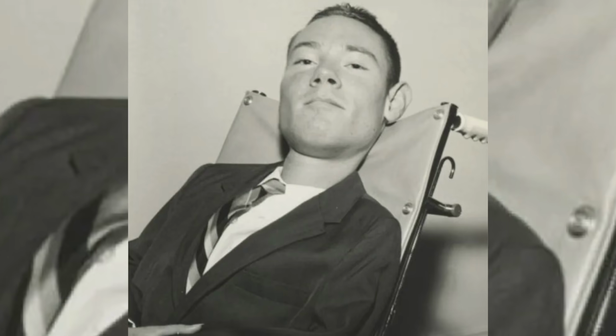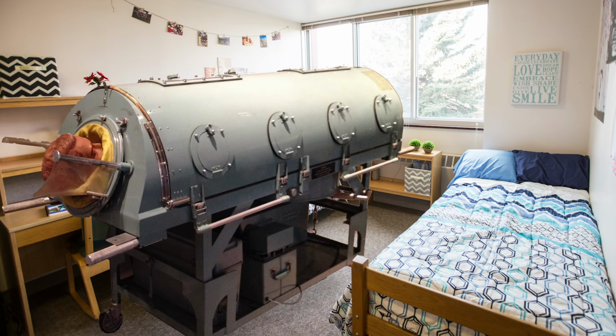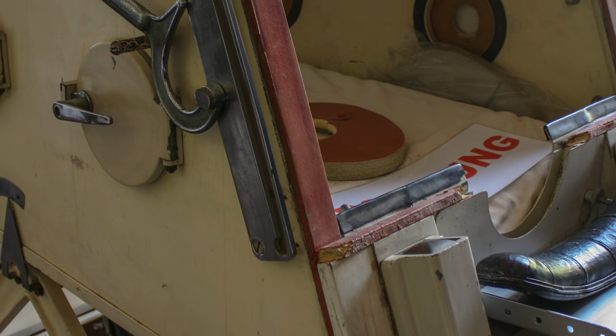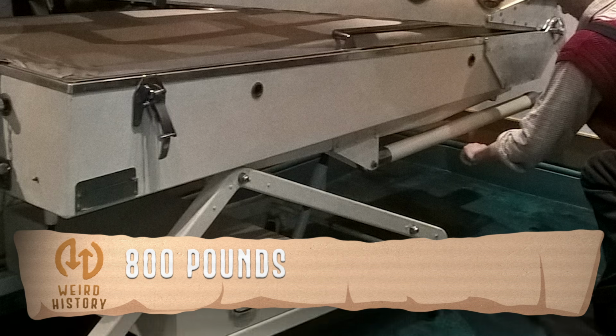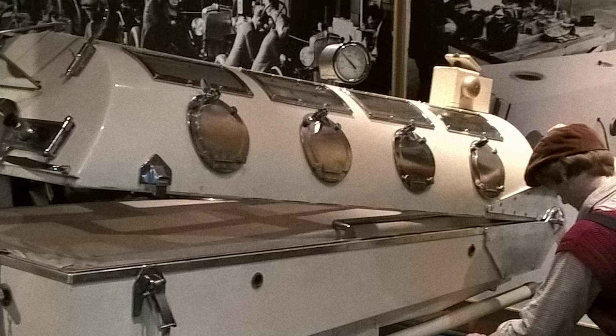Earlier, when we mentioned attorney at law Paul Alexander hauling his iron lung into his dorm room, we probably should have mentioned that these bad boys weighed hundreds of pounds. Not exactly the most convenient thing to rely on to live. These life-saving metal miracles, comprised of tubes, motors, and metal, weighed up to 800 pounds. The size and scope of this guy made things tricky in portability and accessibility and contributed to the stigma of being treated by one.